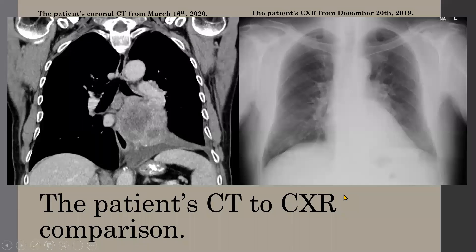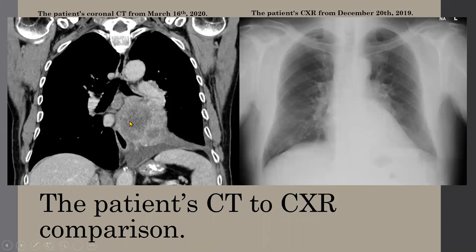Comparing the CT to the chest x-ray, the opacity behind the heart is not just the mass but also the atelectasis itself. The triangular shape seen on the CXR is due to the atelectasis. Together, the opacity represents both the mass and the atelectasis. The more pronounced left hilum is due to tumor growth extending past the wall of the left pulmonary artery into the mediastinum in the left hilar region.